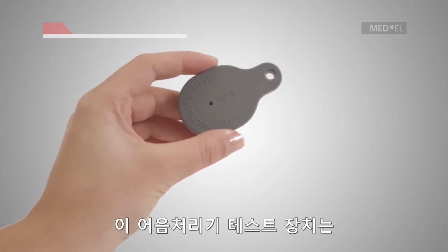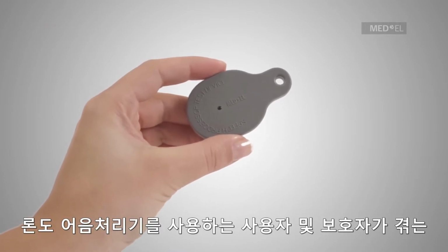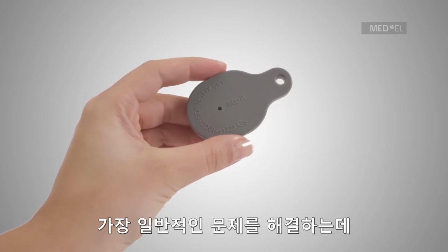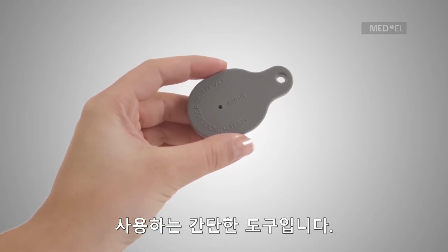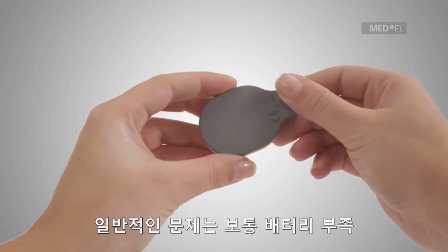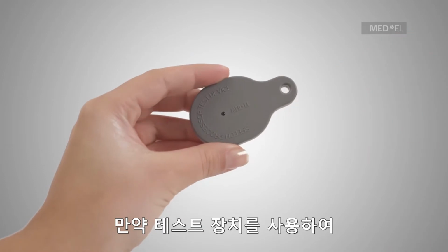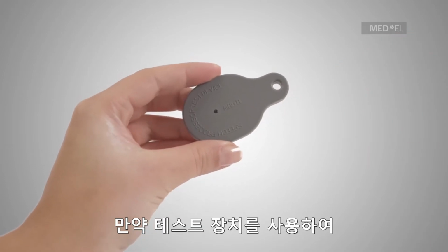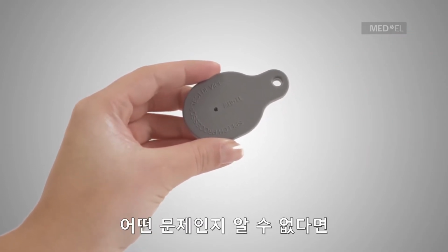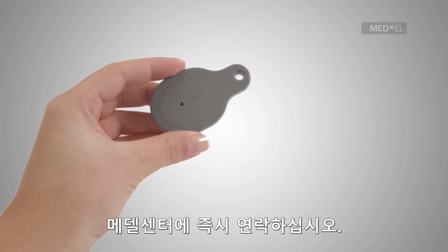The speech processor test device is a simple tool that may be used to troubleshoot the most common problems encountered by users and caregivers interacting with the RONDO audio processor. Common problems may include weak batteries or problems with the microphone. If any problem cannot be fixed by troubleshooting with the speech processor test device, contact your CI center immediately.